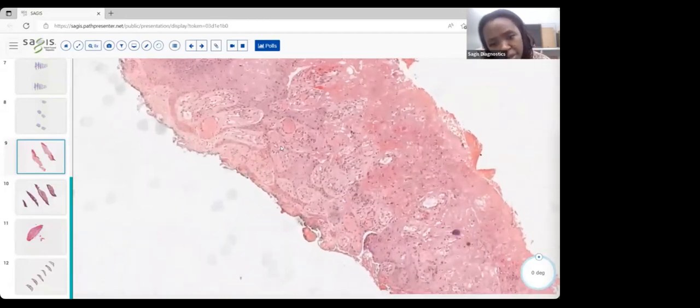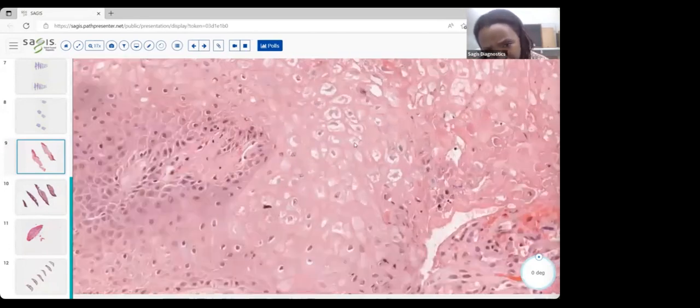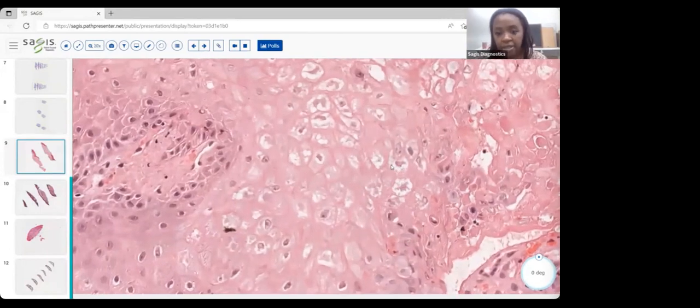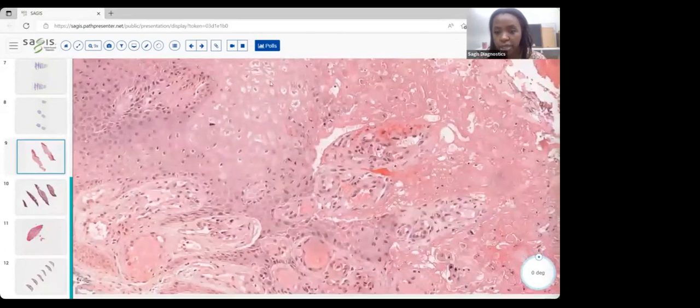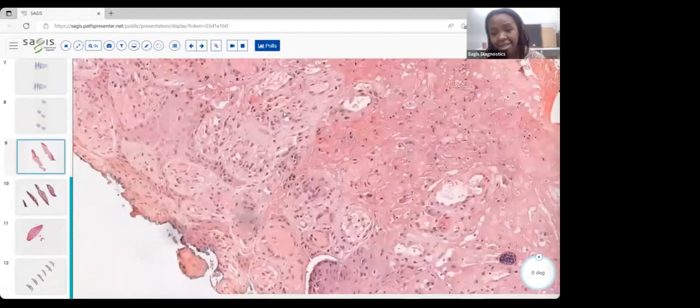Okay, and then what we also appreciate when we take a closer look at these keratinocytes, yes, there's lots of edema, there's fluid in there, but we also have these inclusions inside. We can see that there are some intracytoplasmic inclusions. We're really seeing that in quite a few of these keratinocytes, right? So we want to keep that in mind. We have intracytoplasmic inclusions. So of course now we're thinking about cytopathic effect because that's a form of cytopathic effect.